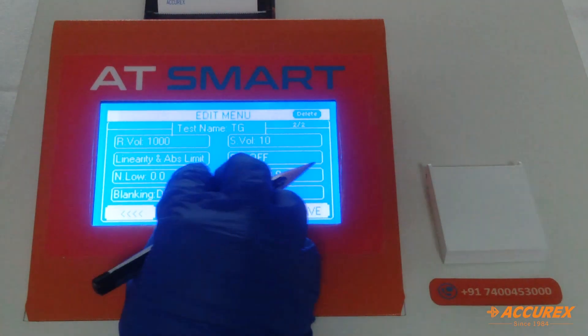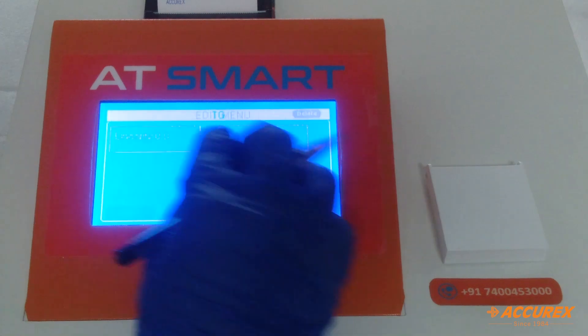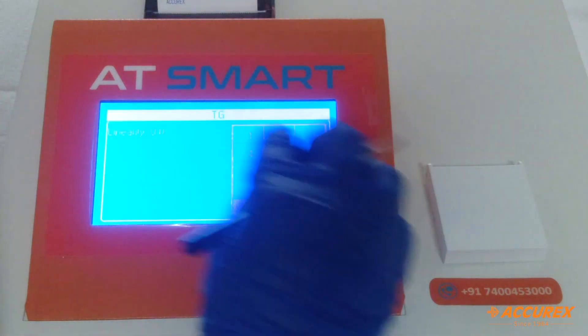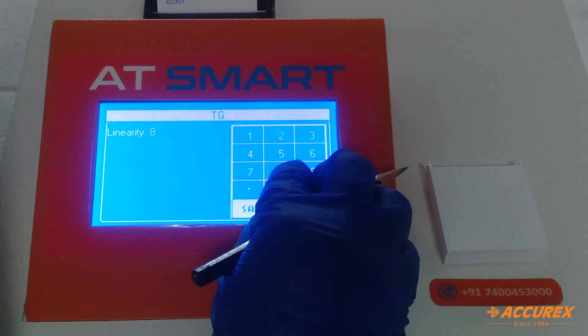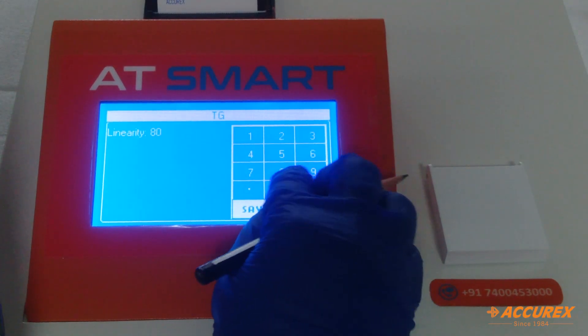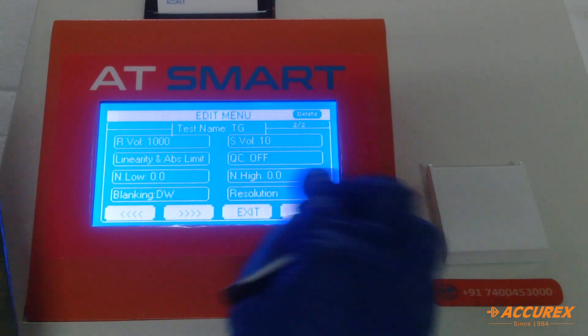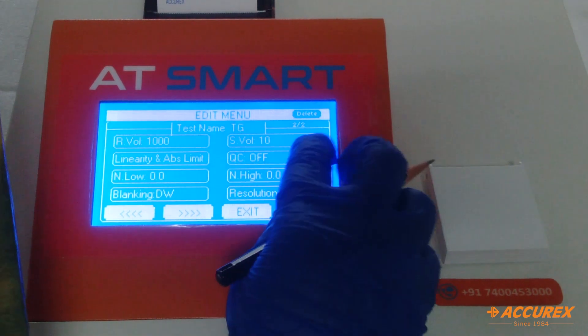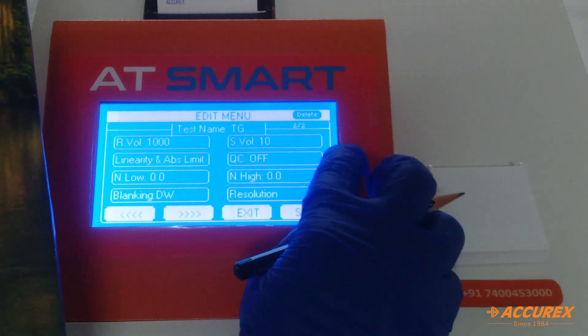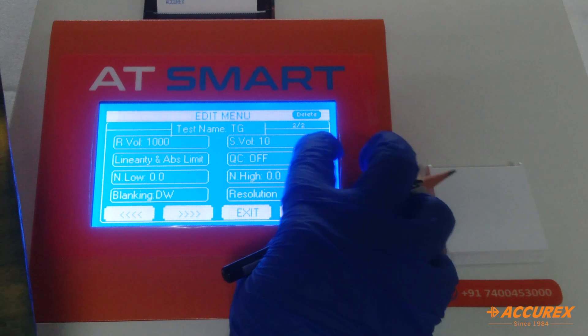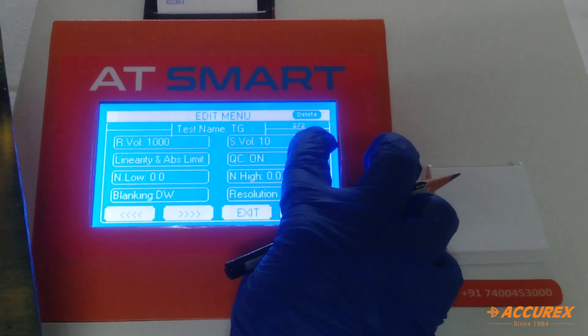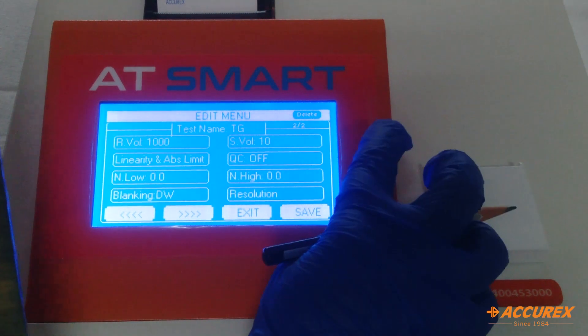For linearity, the value is 800 mg per dL — type 800 and save. For QC, if you want to check QC, there is an option to turn it on or off.